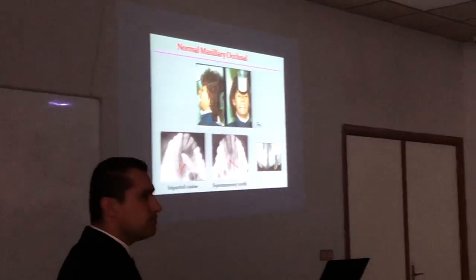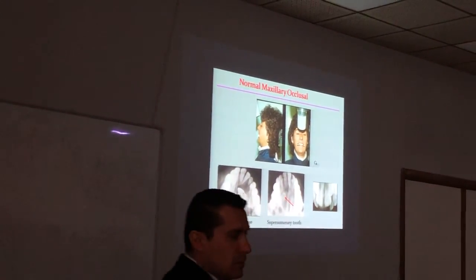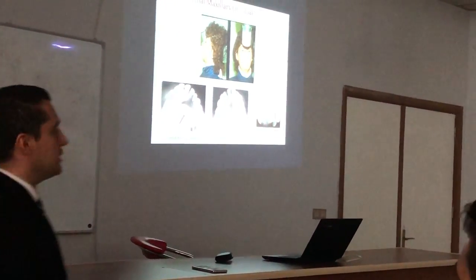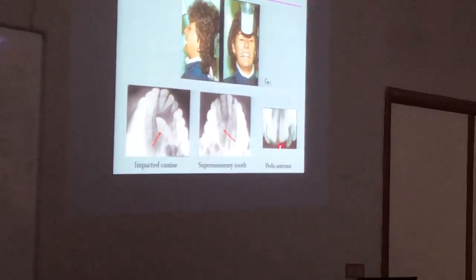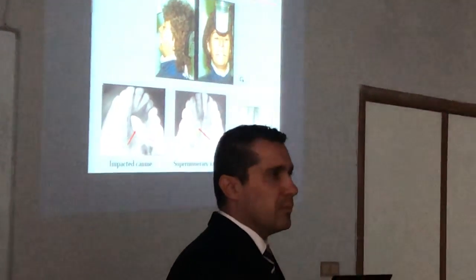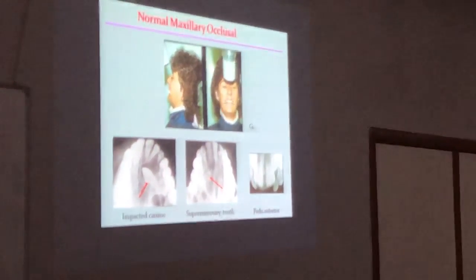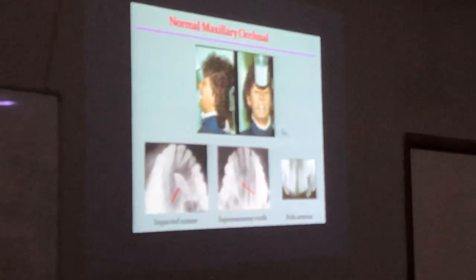Accessory tooth, or the patient complains of it. Okay, what about this? هذا crowded. Huh? Crowded. لا الكراودينج ما تقدر تحددها. هذا بيدونتي. بالضبط هذا pediatric. هذا pediatric for the eruption. Pediatric anterior. Sometimes you will be suspicious that the tooth is not present. مثلا اكو شاب مثلا عمره خلينا نقول هو سنترال سيجي ب8 وعمره 9 سنين بعد السنترال بطال. You will be suspicious for the presence or maybe congenital missing of the tooth.